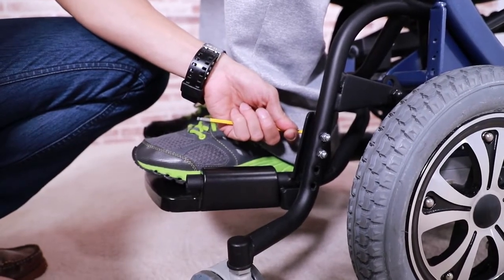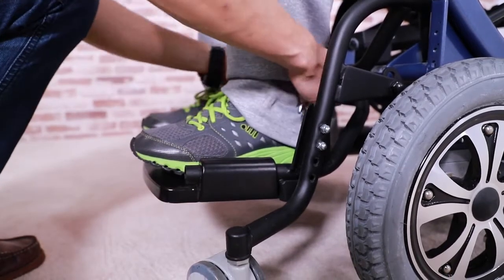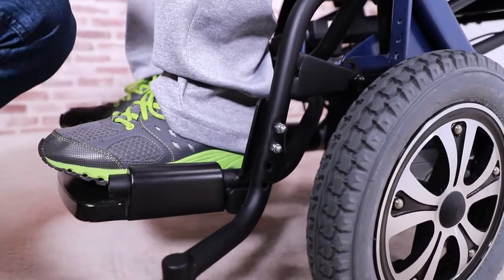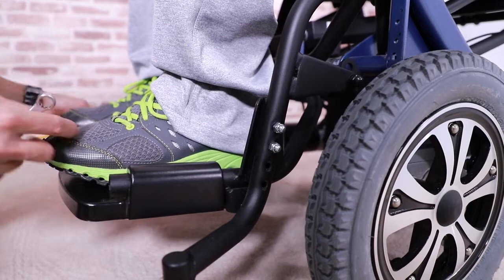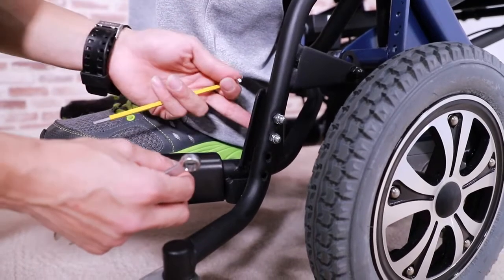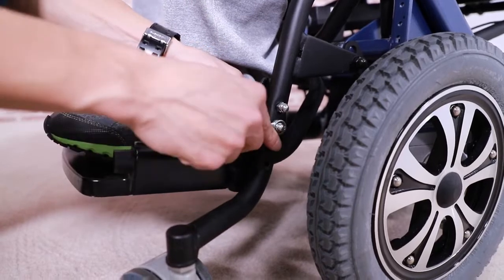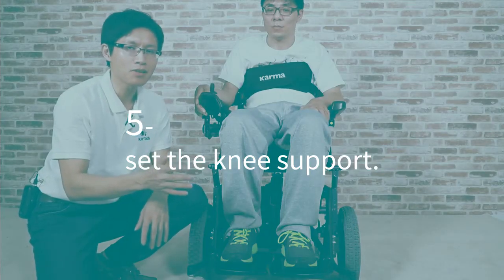Now, here's another tip. 2 foot plates are connected to each other through a horizontal bar to provide additional rigidity. Therefore, when we want to adjust both sides of the foot plates, we want to first open up the bolts from 2 sides at the same time, adjust them, and then reattach them.